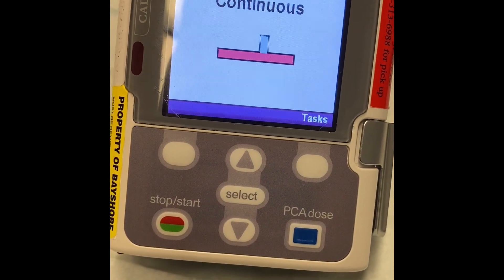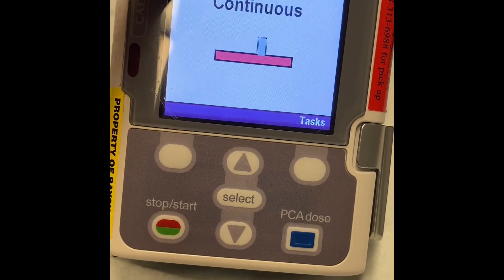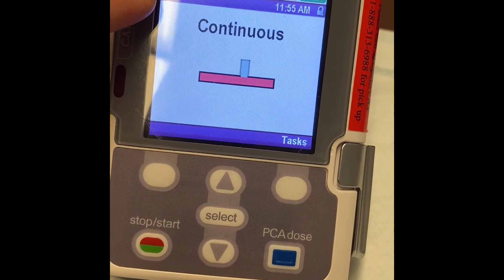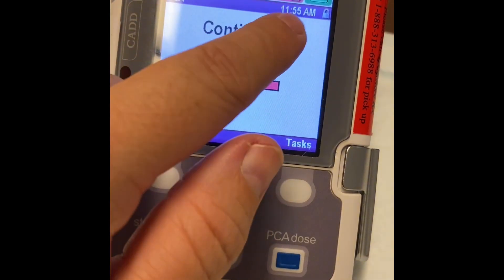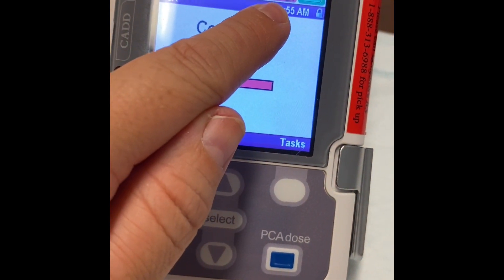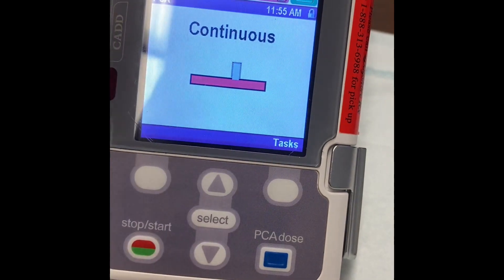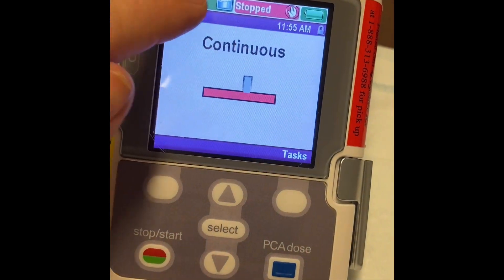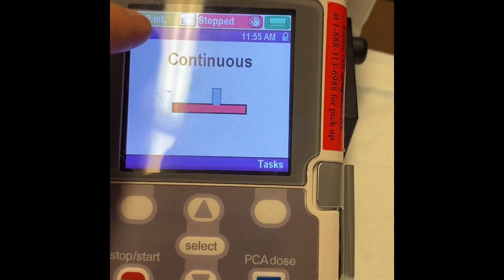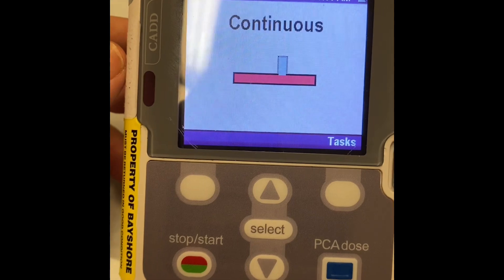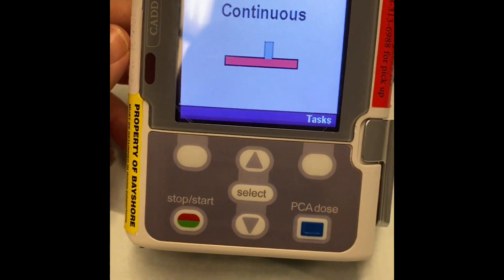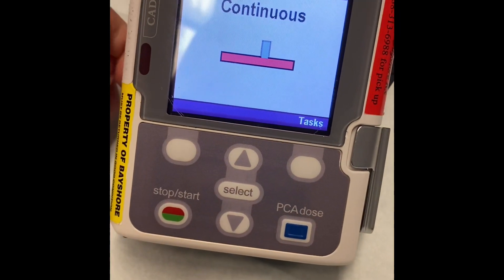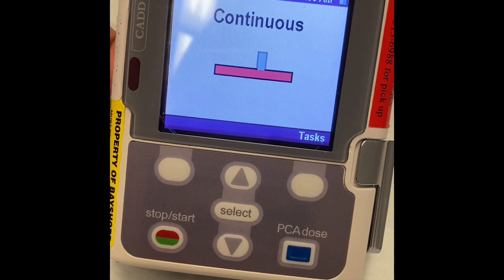You'll see here that the pump is set to PCA. It's stopped — it's not running currently. And this is your reservoir, so that's how much milliliters are left in your medication bag.